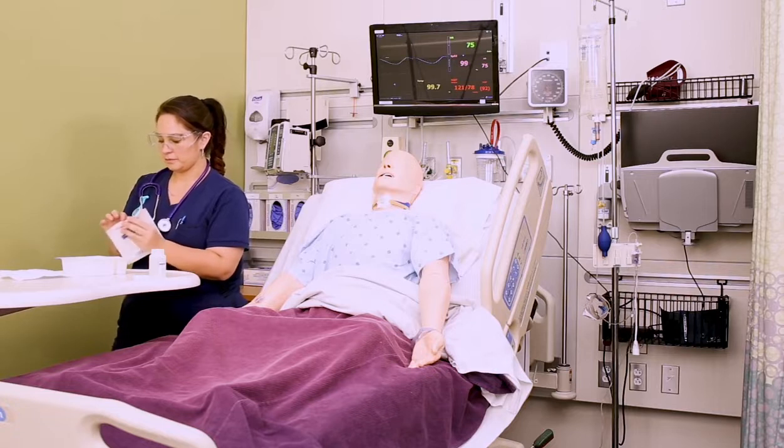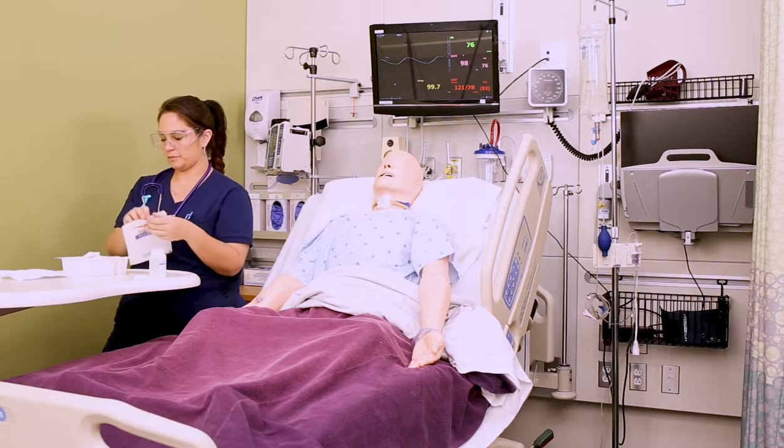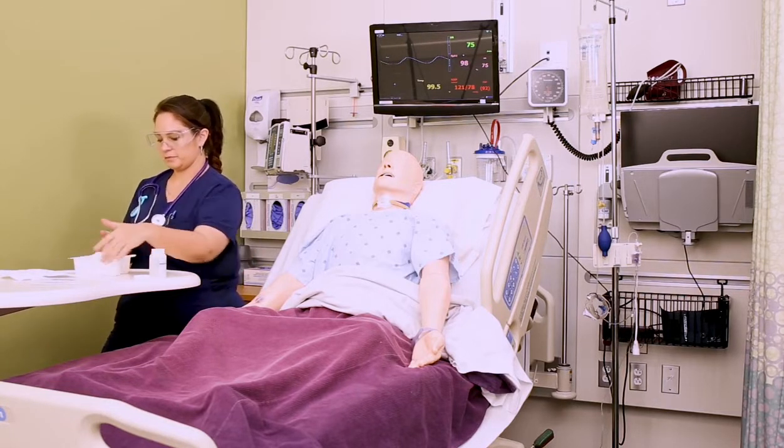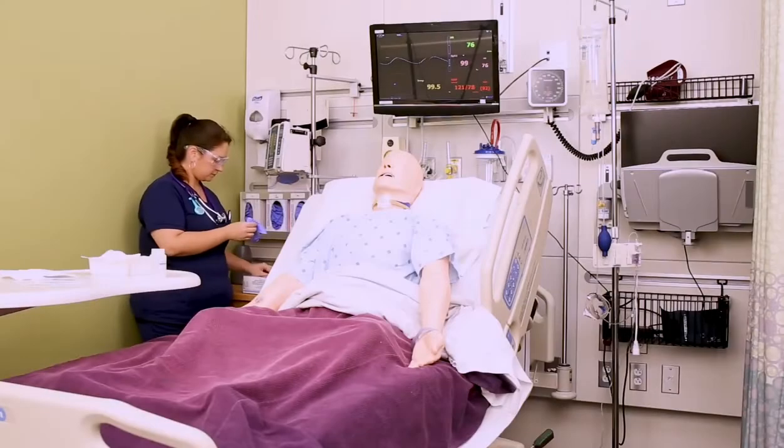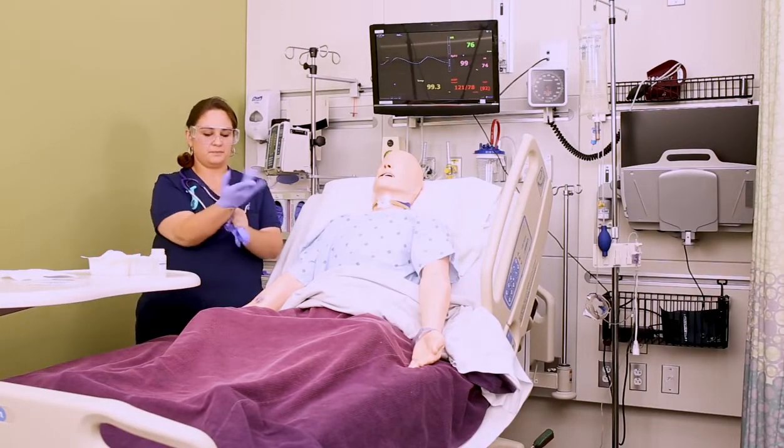So there's other supplies you might need access to. So you're going to open those onto your sterile field inside your kit. The new dressing, the new inner cannula, and the trach ties. So now if your trach ties or trach holder isn't sterile, just open it and set it next to the sterile field. So apply a pair of clean gloves.